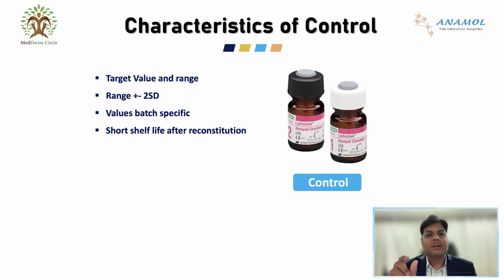Some parameters, whatever the range mentioned in the value chart, that range is stable only for the first 48 hours after reconstitution. But for some analytes, the range is applicable for 30 days after reconstitution. So for different analytes, there is a different shelf life after reconstitution.